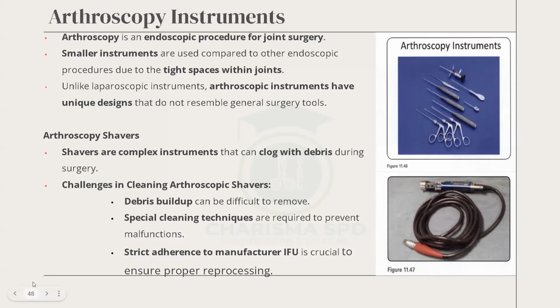Getting to the round silver piece on the same picture. Before where the cursor is, you see those two dots. Those two dots are buttons. That is what the surgeon is regulating. So those ones also come dirty. You have to clean them. This piece is hand washed because the IFU does not allow it to go through the washer. So you have to manually clean it.